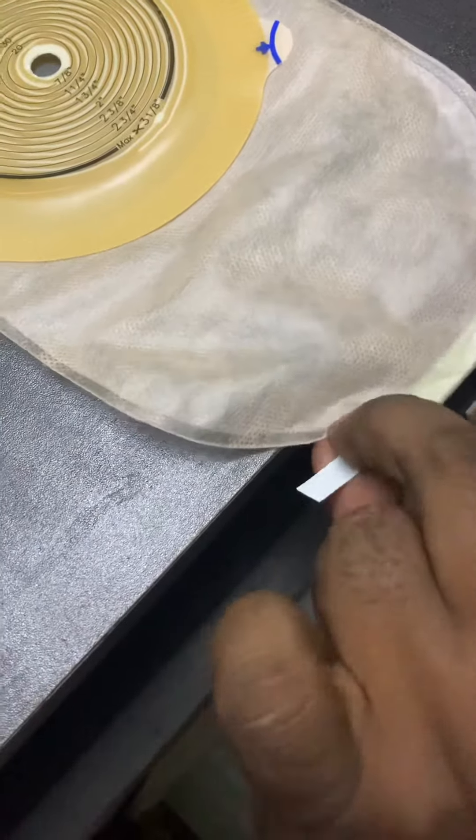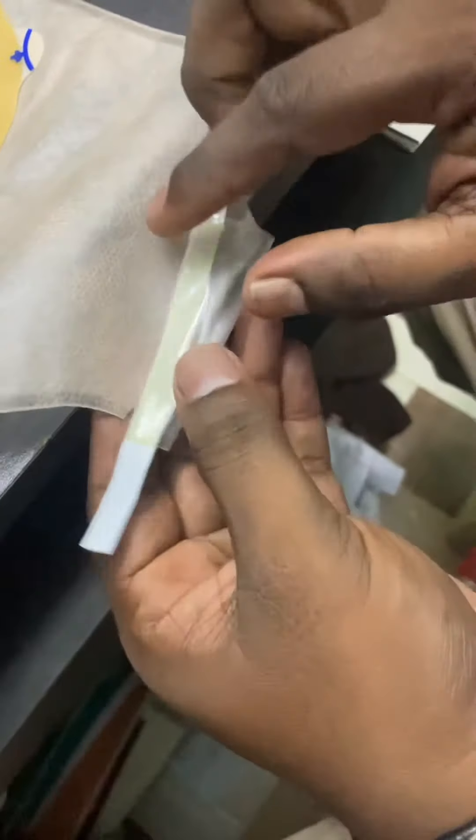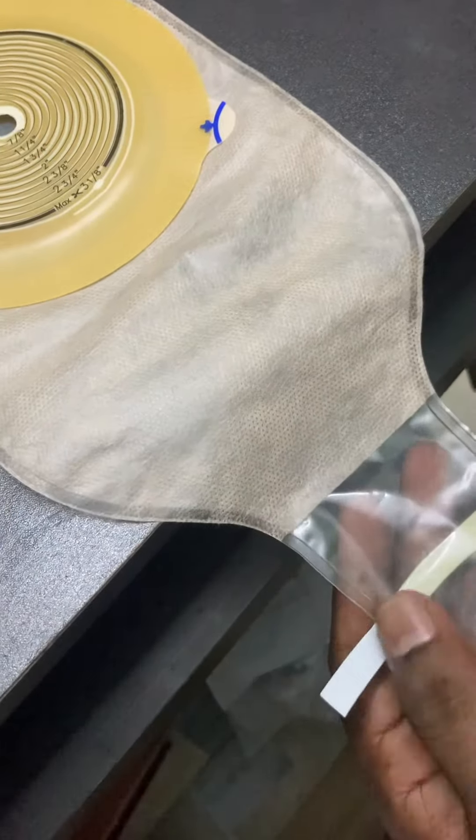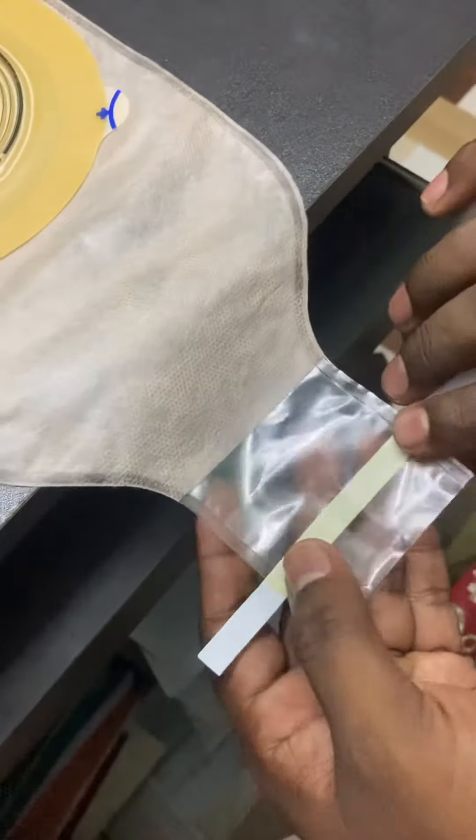Fold it like this and use it. When you want to open it, just straighten both ends and drain it out this way. Okay, thank you.